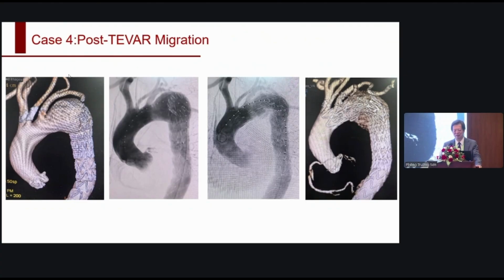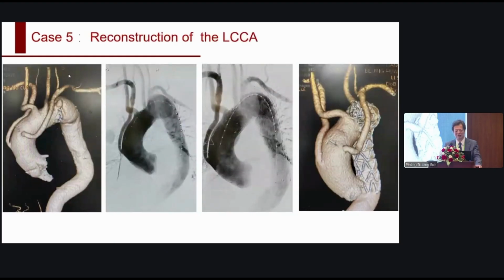Then he came to me. So we can use a Castor passed through the first stent graft, then deploy inside to the LSA, plus elongate the chimney stent graft to the left carotid to rebuild 2 branch vessels. In this case, the total operation time is only 1 hour. It's very quick, no complications. Especially for the aberrant subclavian artery, we can also use this device to rebuild.